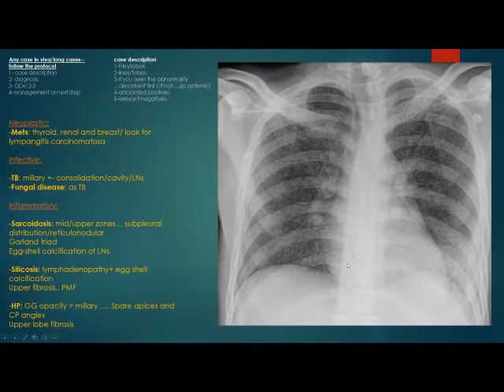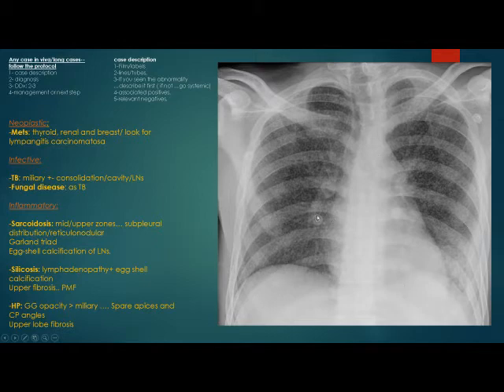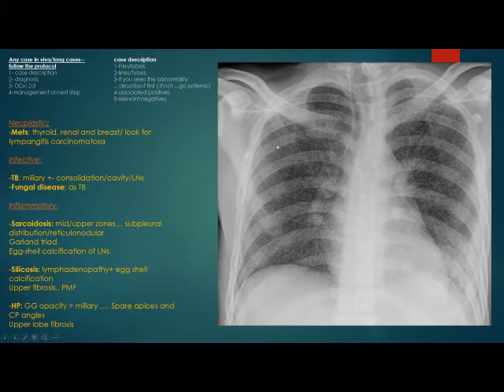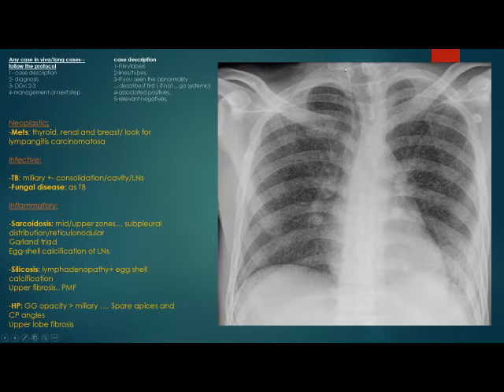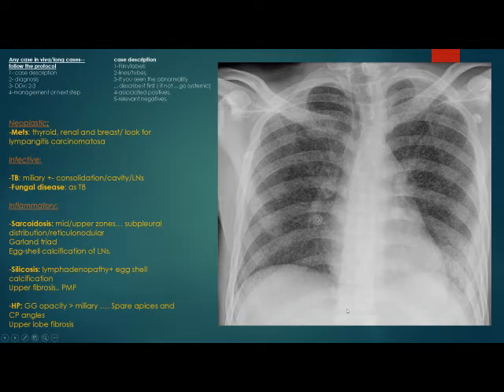The third point: look carefully for any relevant secondary findings. Take your time and tell the examiner what you are thinking about. In a miliary pattern, look for the breast shadow and any mastectomy, and axillary clips indicating primary or metastatic disease. Look in the neck area for calcification or soft tissue thickening indicating a thyroid mass. Look carefully in the paraspinal region for thickening due to Pott's disease, which would indicate TB. Finally, look under the diaphragm for any abdominal pathology.